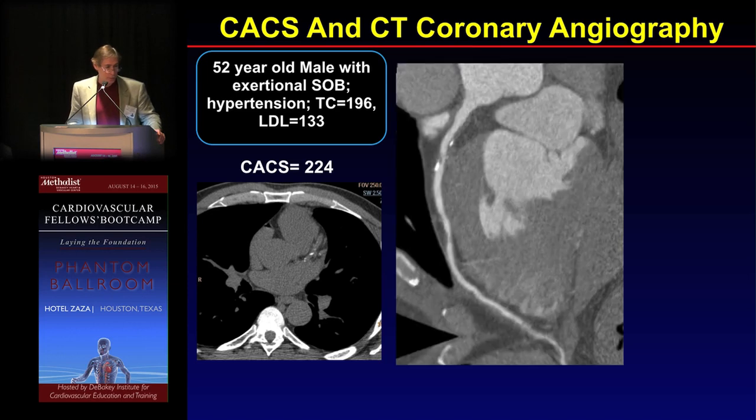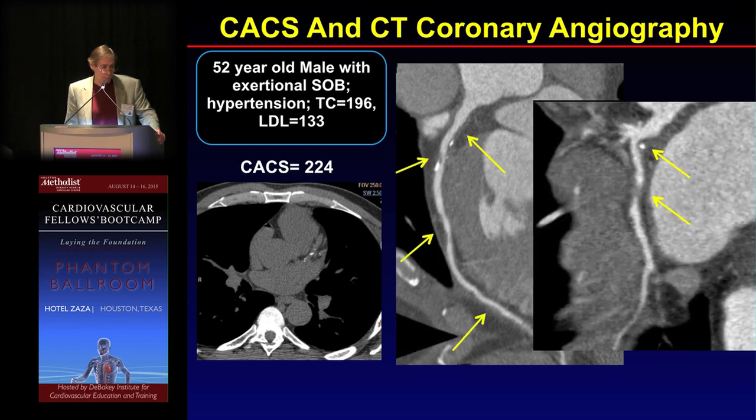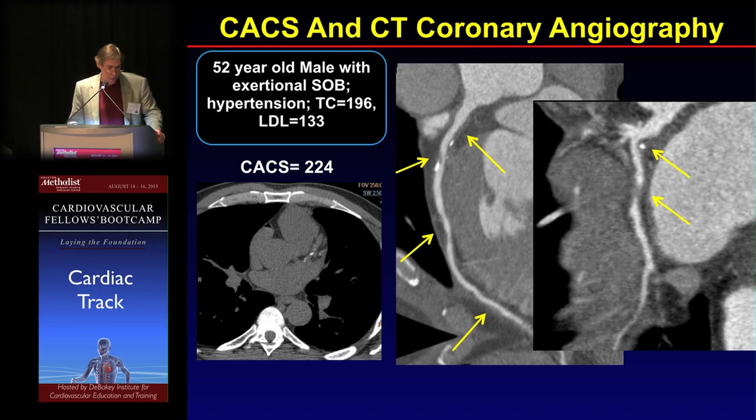This just happens to be this patient's CT angiogram, which was performed because the patient was symptomatic, which is why we do CT in symptomatic patients. And this is both shots. And you can see that this patient had extensive plaque. And you don't just see a luminogram. You actually see the wall. So this is all plaque, non-calcified plaque in the wall, as well as calcified plaque. And you're able to quantify the extent of stenosis. So very, very helpful technique.